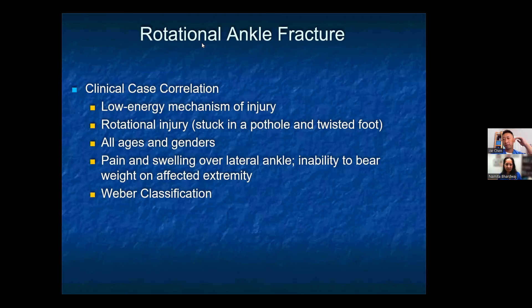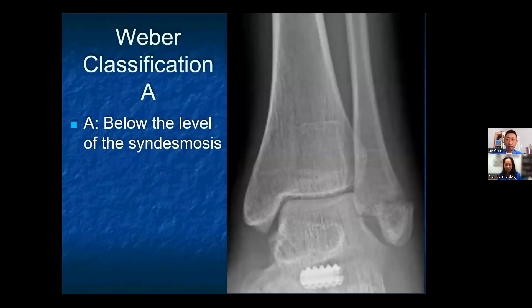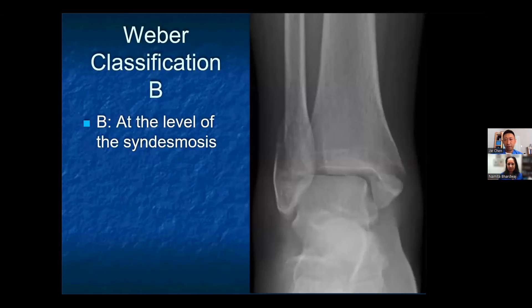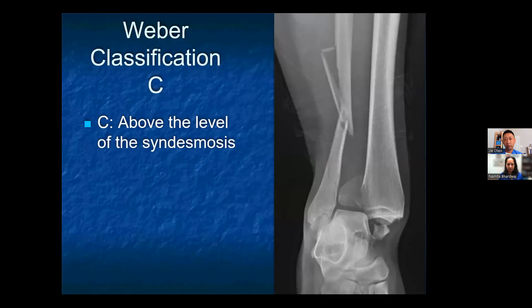The simplest and most commonly used classification system for rotational ankle fractures is the Weber classification, which classifies the fibula fracture. A Weber A fracture is below the level of the syndesmosis. A Weber B fracture is at the level of the syndesmosis. Weber C injuries are fibula fractures above the level of the syndesmosis.